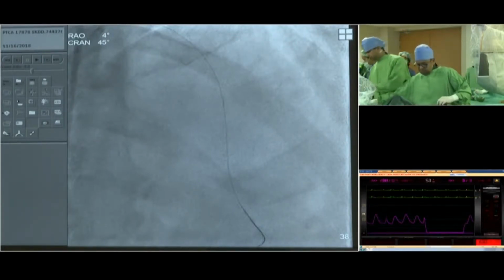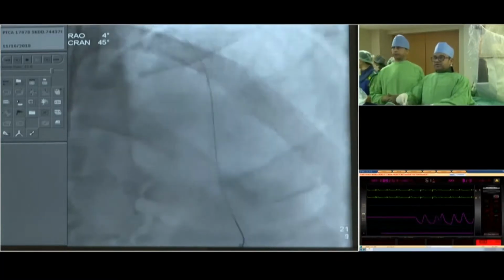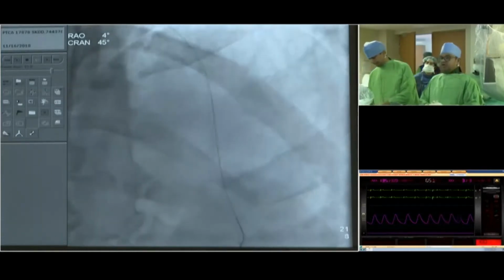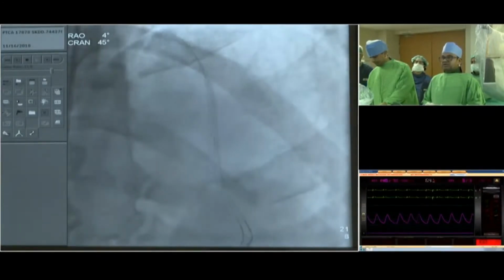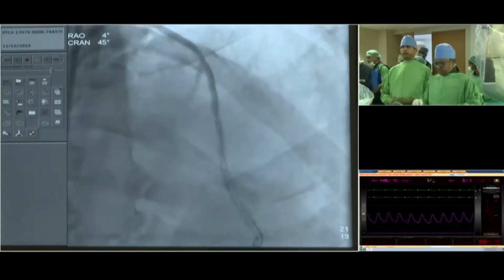3 balloon should be ready. Beautiful. So this looks okay. The distal end is slightly oversized. So proximally we have to do more optimization. So can we have a 3 into 13? We have a mosaic balloon 313, NC please. So as you know, we can go up to 0.5 millimeter quite easily for post dilatation. But in this case, the sizing looks good, and we have the imaging technology also. So we'll reconfirm it before going more than 0.25 size in this case.